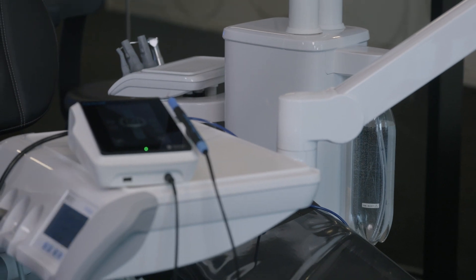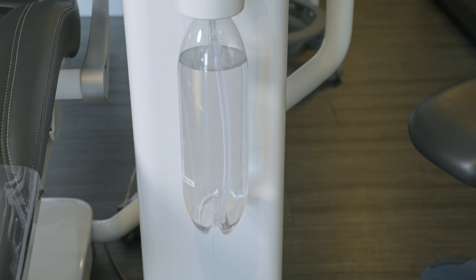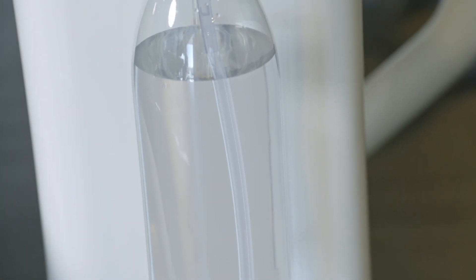If you connect your Cavitron scaling system's waterline directly to the dental chair, where the water is delivered via an independent water bottle or reservoir, you will follow the dental chair manufacturer's instructions for use for treating and shocking all the waterlines. The treatment and shock products that are recommended in the dental chair manufacturer's IFU, or instructions for use, will serve as your Cavitron scaling system's waterline maintenance method.